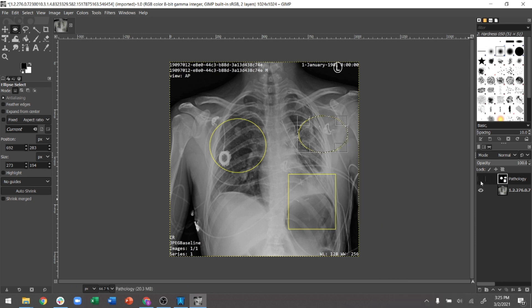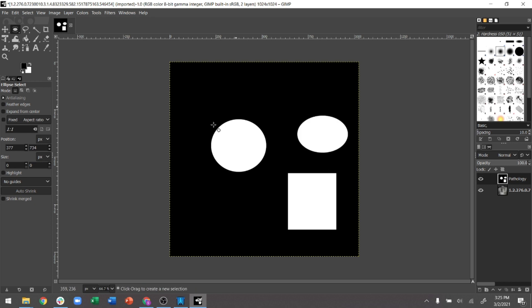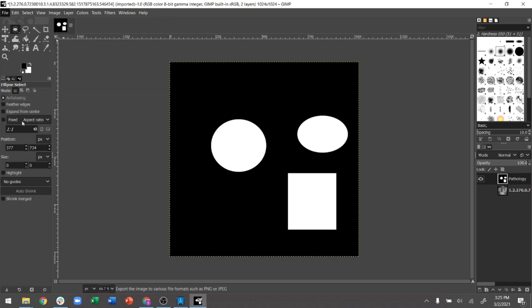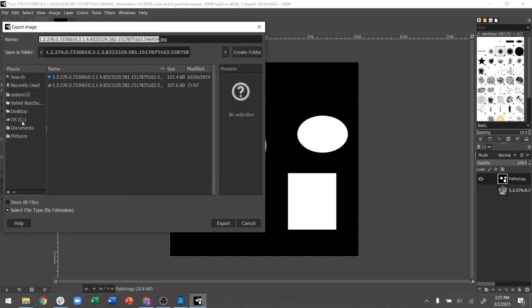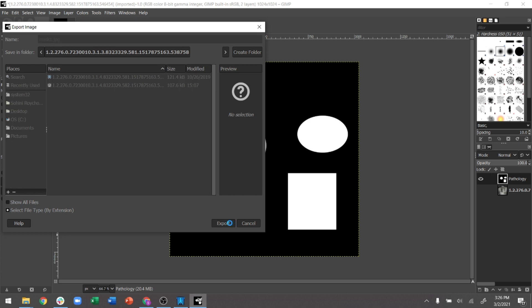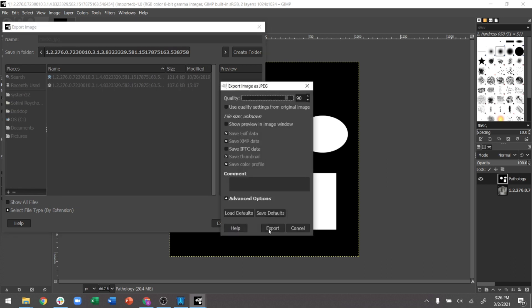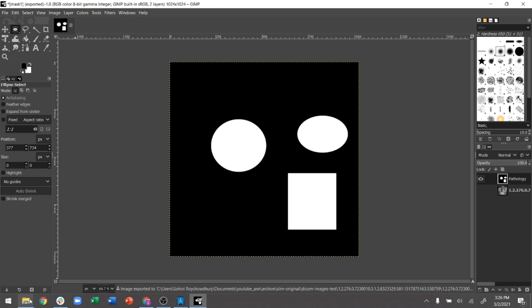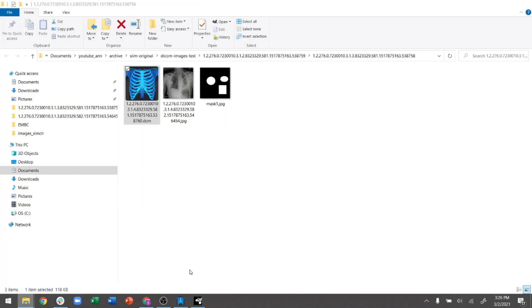Making sure you're looking at the whole image, you can see these become your annotated regions of interest. Now remove the eye from the actual image layer, go to Export As, name the file — for example 'mask one' — and hit Export. It will ask about quality settings, and once done, you'll be able to see the exported mask right next to your original image.